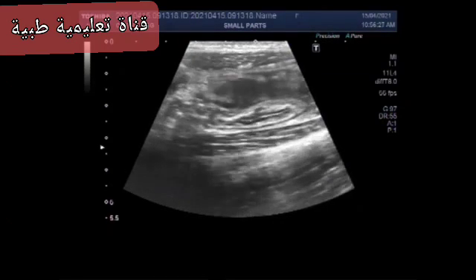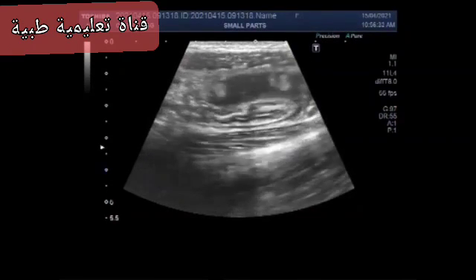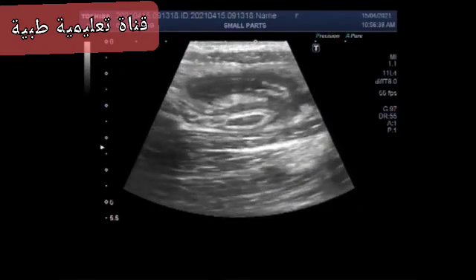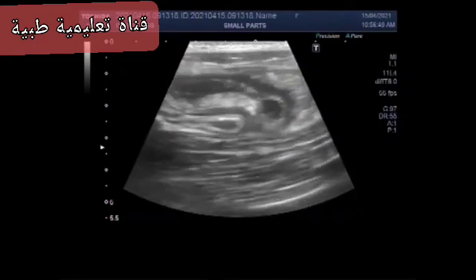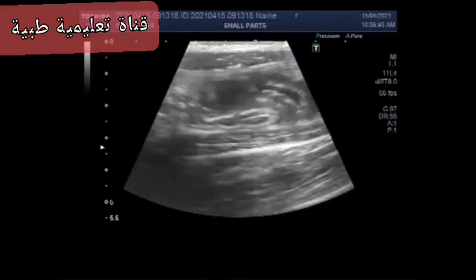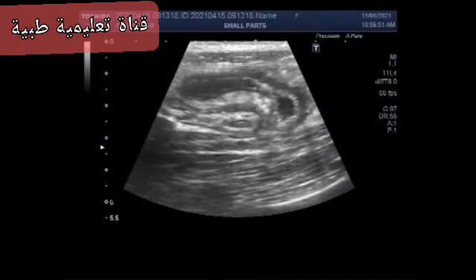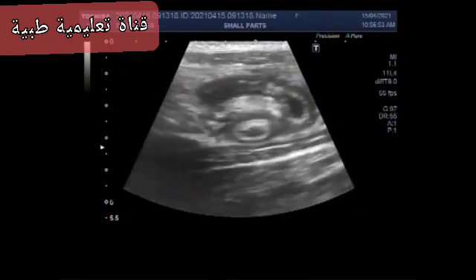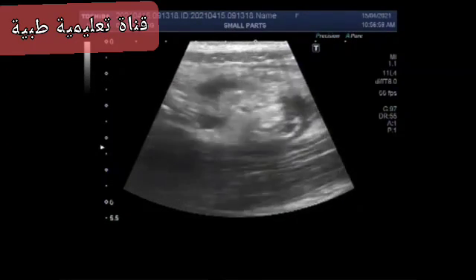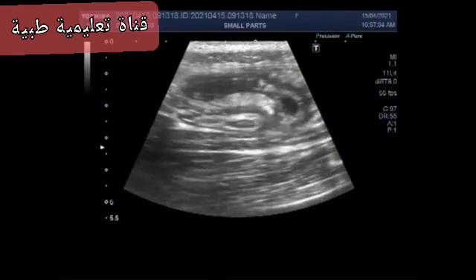You can see the inner lumen is hypoechogenic with hyperechogenic edema surrounding it. Now if you scan in the long axis, the appendix will appear in a tubular form with the same pattern. Inflammation may occur when the appendix becomes infected or blocked with stool, foreign objects, or a tumor. Tumor is very rare, of course. Now you can see the whole length of the inflamed appendix.